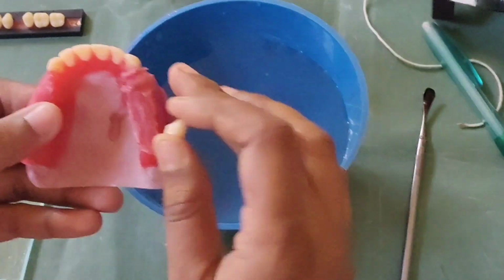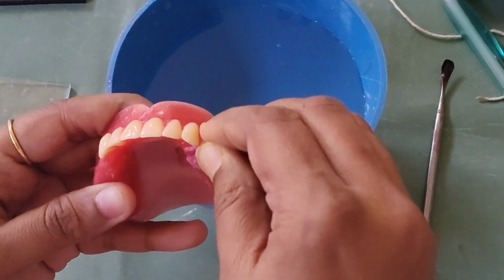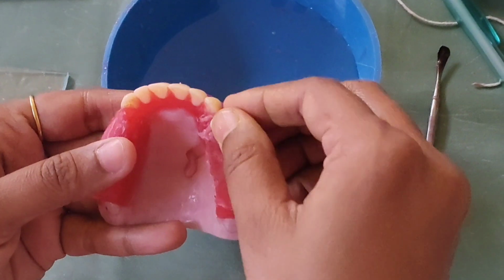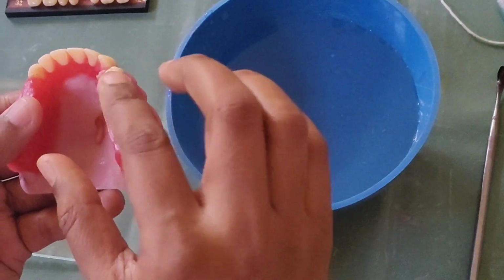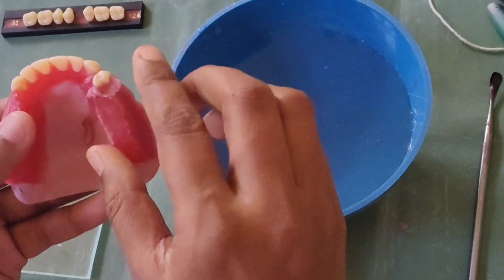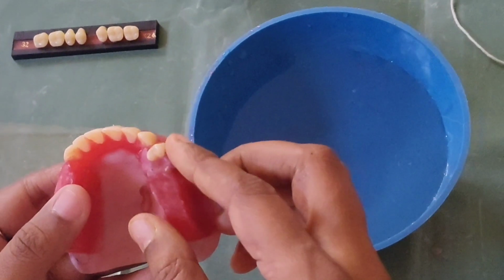Don't melt the wax completely, soften it so that you get how much we require. If we have reduced extra, we have to add wax in that case. If we have softened, the extra will automatically come. If we have removed extra, then we have to add. So just soften it and place it.